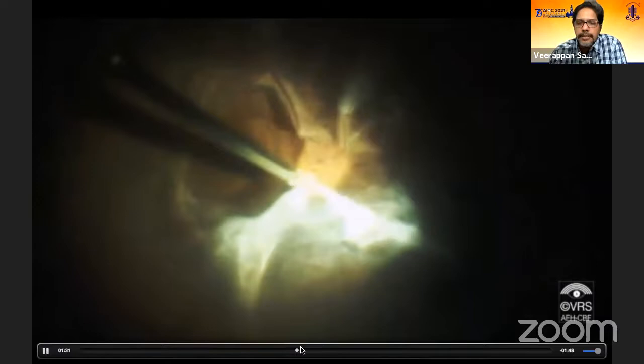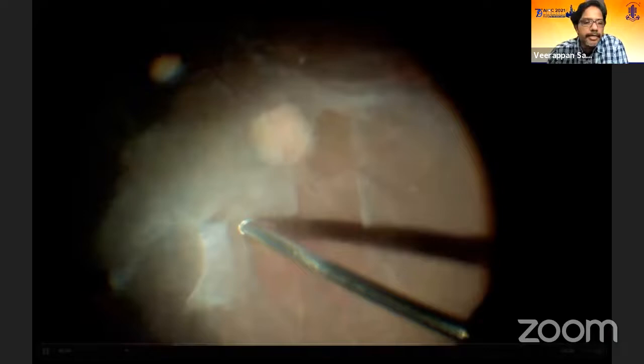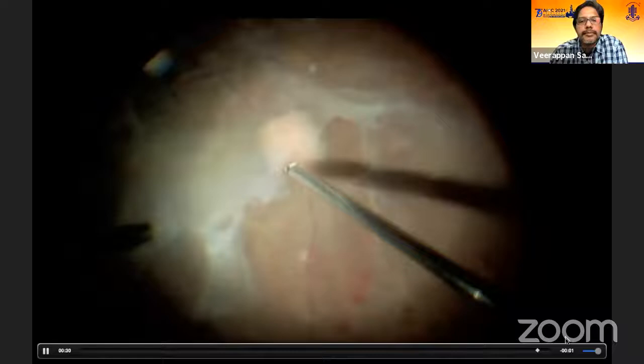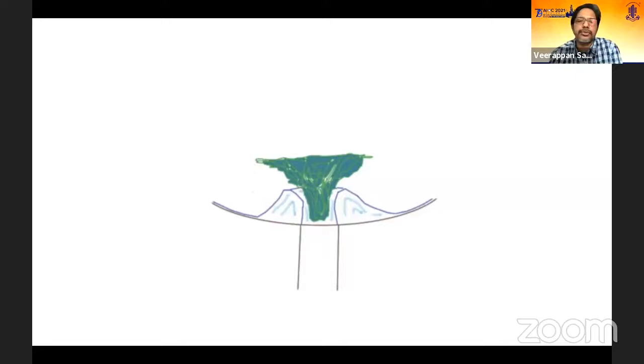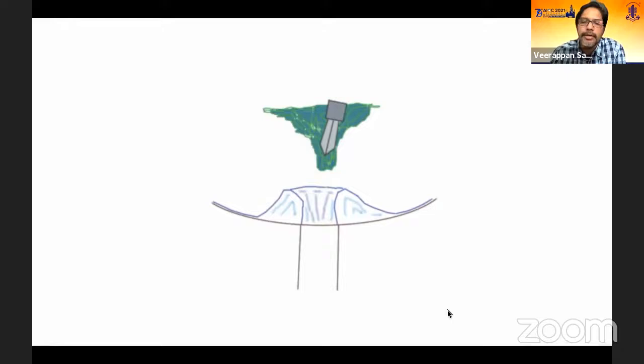When peeling the disc membrane, if you're in the correct plane it's much easier. During this peeling technique you can encounter disc bleeding. In chronic TRDs you have a crater-like cavity at the disc. Trying to address the membranes in an anterior-posterior direction can create iatrogenic breaks, so peel them in a more tangential way — hold the membrane in the deep part of the crater and pull tangentially rather than anterior-posteriorly, as vertical traction creates significant pull and iatrogenic tears.